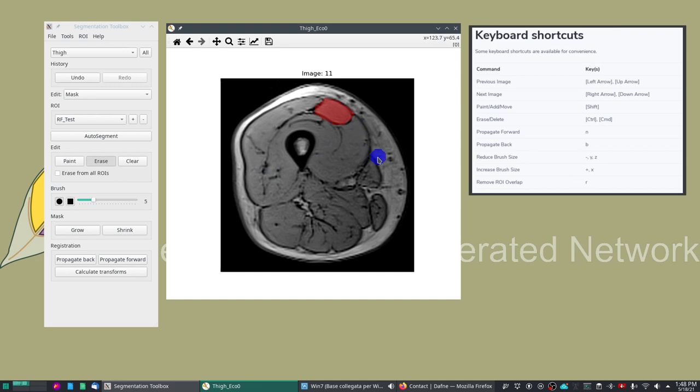The ideal format for this program is DICOM. It also supports enhanced DICOM as produced by Philips and it also supports of course numpy arrays.